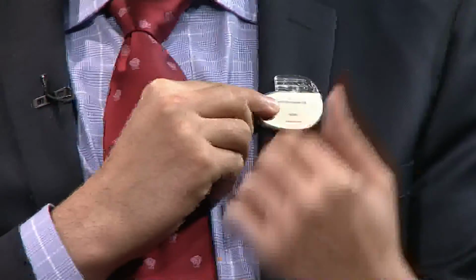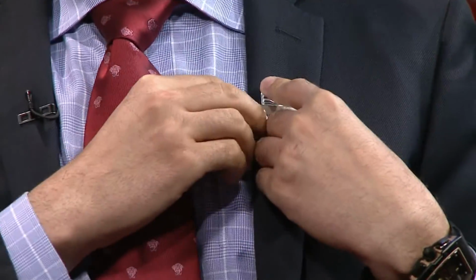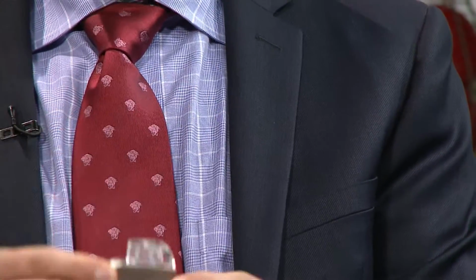Okay. If the heart becomes very slow, the pacemaker substitutes for the electrical engine in the heart that keeps it going, and delivers the electricity to the heart. This is a pacemaker that we implant with a very small incision under the skin. From it, there's a wire that extends all the way to the heart and delivers electricity that keeps the heart moving. Implanting this pacemaker takes about 40 minutes. So 40 minutes, not too bad. Or 1 hour. Not too bad.